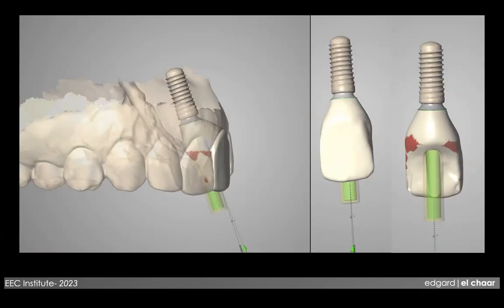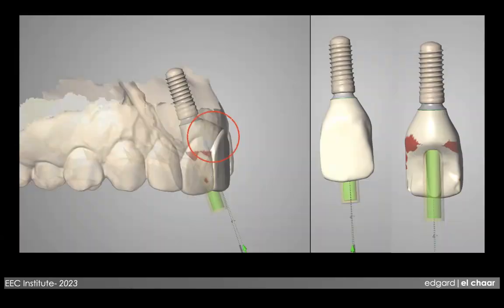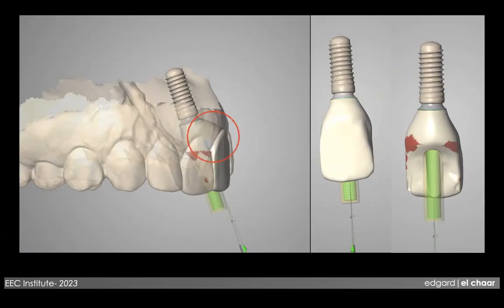We reduce the number of mistakes, with more accuracy, more control, and more positive outcomes for the patient. And we make the patient more comfortable during the procedure. And you see now, we talked at the beginning of the podcast about the implant being circular and the crown of the central being more triangular. And you can see it here vividly because now it's digitally printed. You can see it as an image. And that's what we are trying to create. So that's the important part.